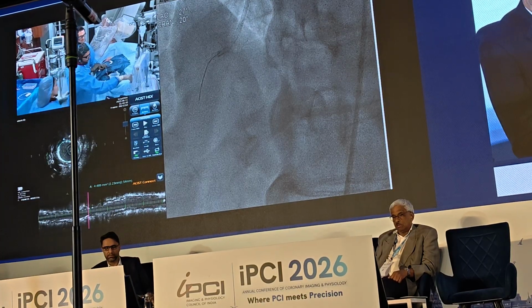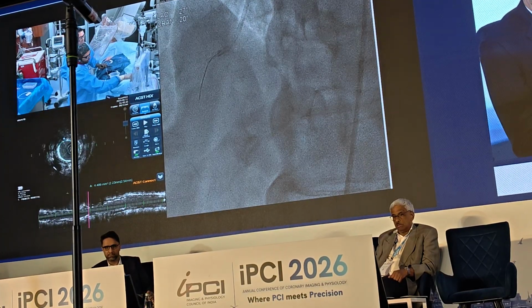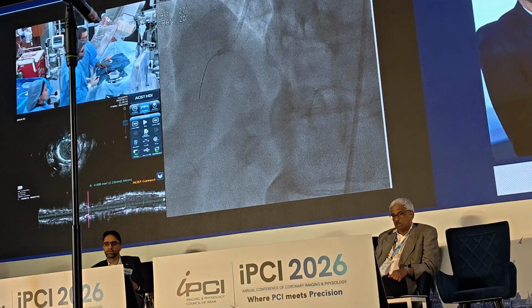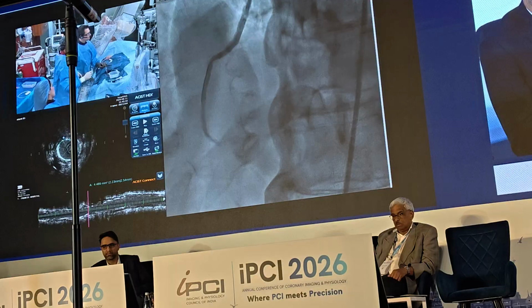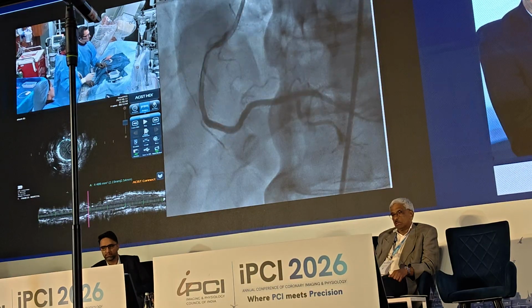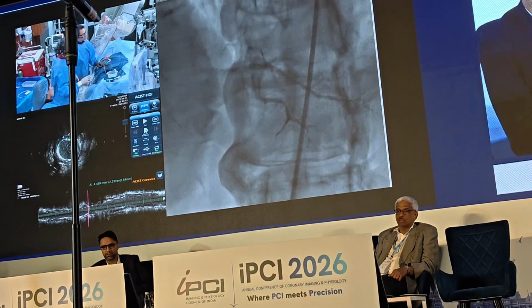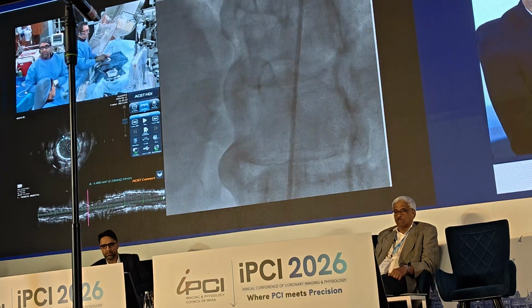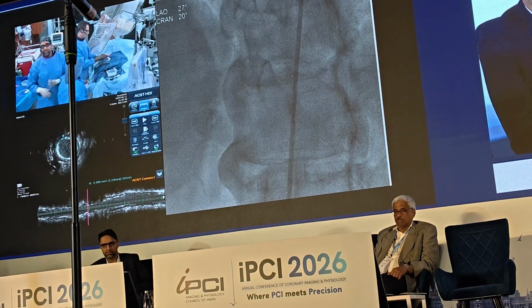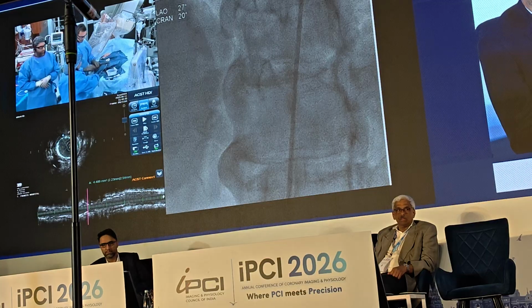So I know right now how much is delivered on each injection. So we injected 0.8 mils. Now Evan's going to take a cine and I'm going to do an injection. And that's it. Okay, so our last injection was 4.4 mils, and that means that the team can actually record that. So in this vessel, we used a total of 7 milliliters.